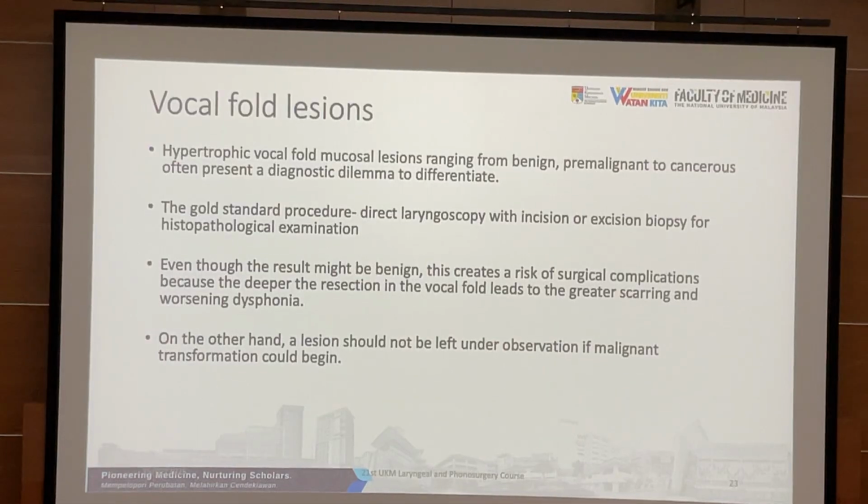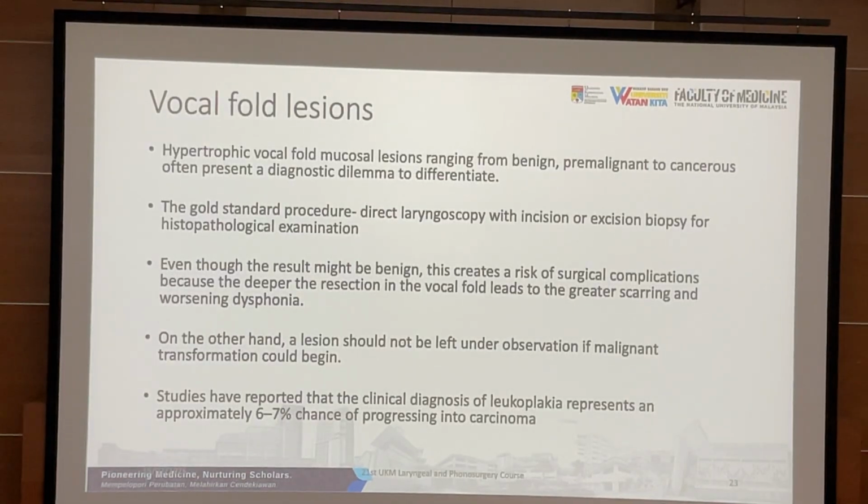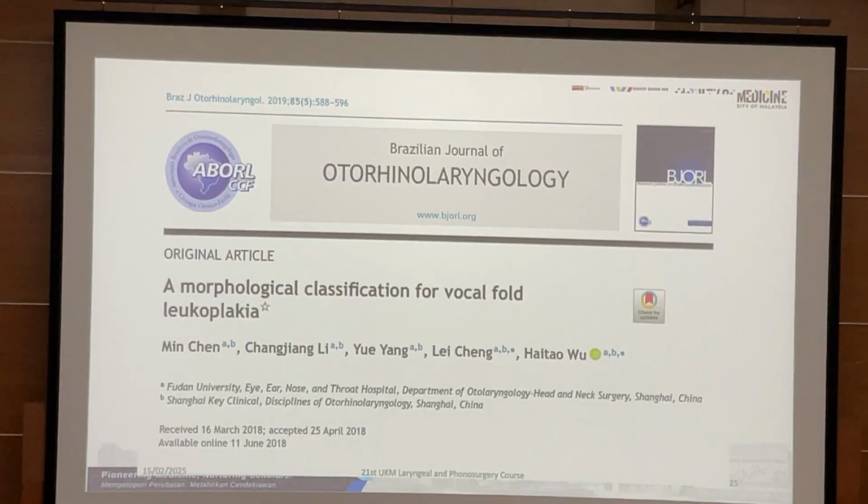So there is a dilemma. On the other hand, if you leave it behind, you just observe, the thing may progress and become cancer. So that is the dilemma in managing vocal fold lesions. So you need a good instrument to examine lesions on the vocal fold. Having a good instrument is not a luxury, but a necessity in diagnosing vocal fold lesions. Let's say you don't have stroboscopy, you do not have eye scan, but at least you must have a video endoscope with camera at the tip for you to be able to examine the vocal fold lesion.